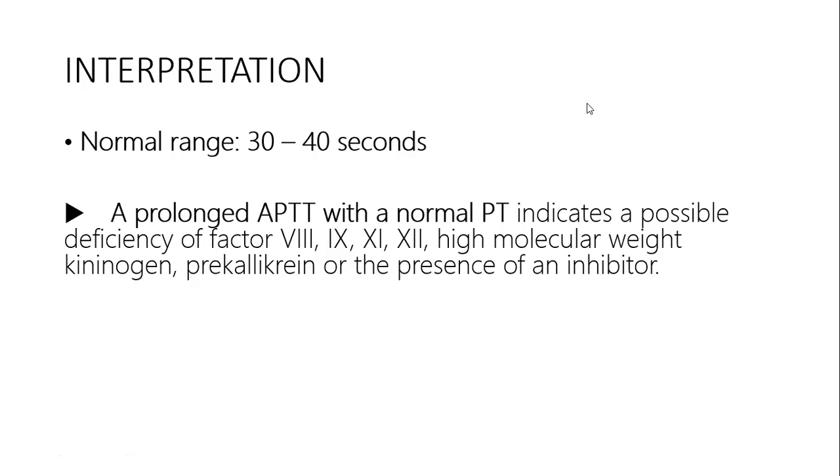Now, for the interpretation of the result, the normal reference range should be 30 to 40 seconds. A prolonged APTT means the result is greater than 40 seconds.